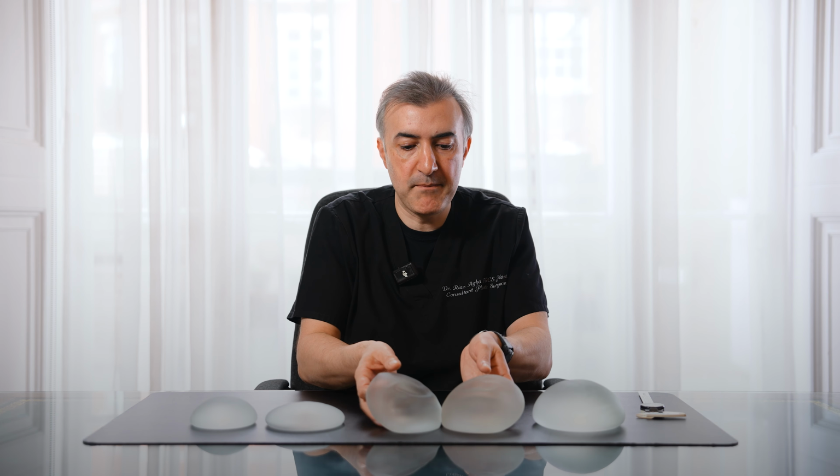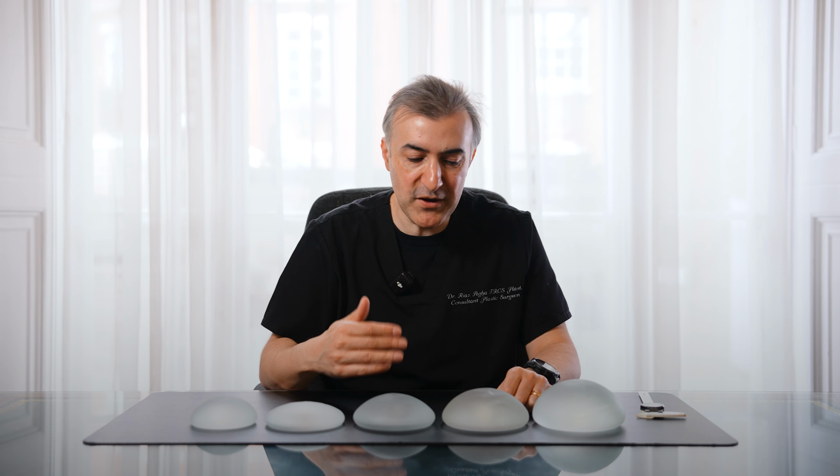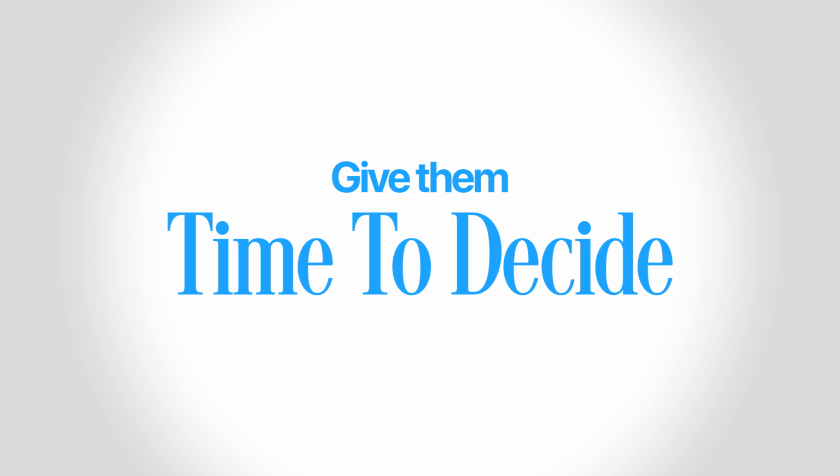And so you can come to narrowing this down to maybe 2 different projections that they could have. And you would be able to compare both of those in a surgical bra and go, okay, this is what you can have. Which one do you like better? What would work best for you? What would achieve your goals? And there's probably a degree of umming and ahhing sometimes about this, a bit of back and forth, a bit of looking at it, comparing, and that can be a variable length of time depending on different patients and how quickly they make decisions. But it's very important that we give them the amount of time and space to do that.